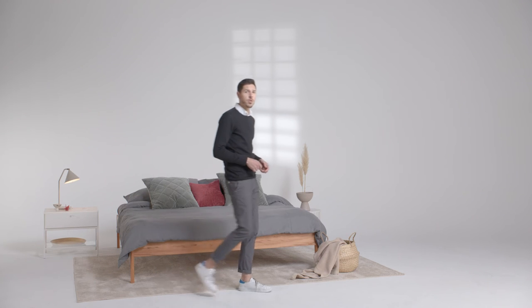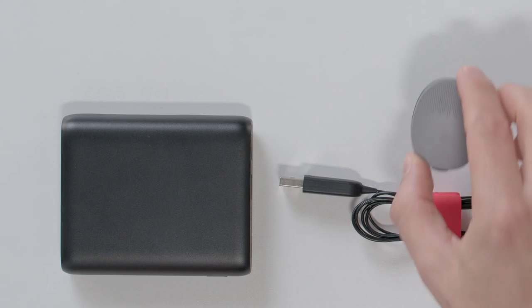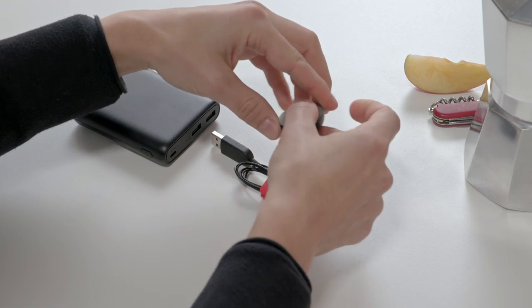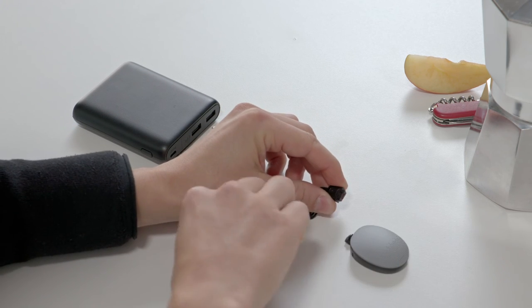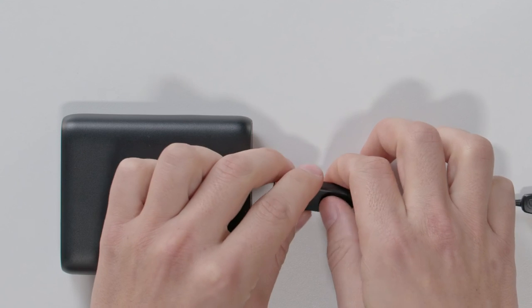You can also charge RONDO 3 on the go using the RONDO 3 charging cable and the power bank. To charge RONDO 3 using a power bank, first open the rubber socket cover at the bottom of your audio processor and plug the charging cable into the socket. Then plug the other end into a power bank.